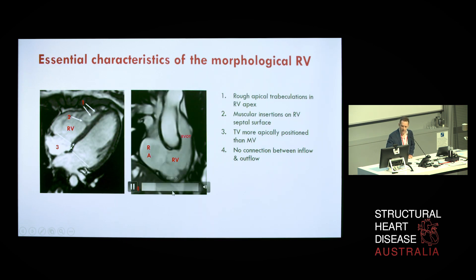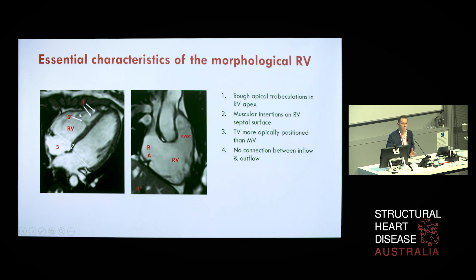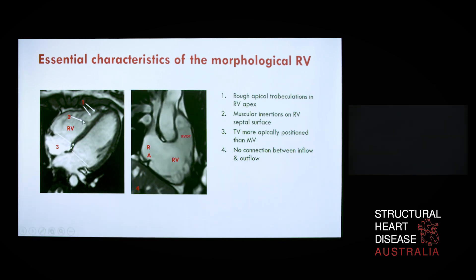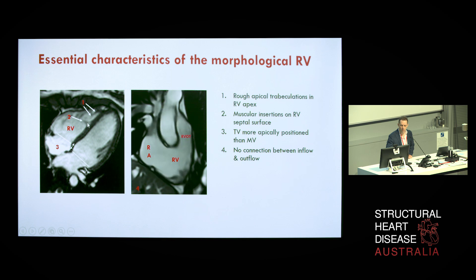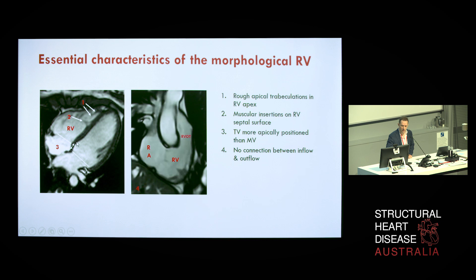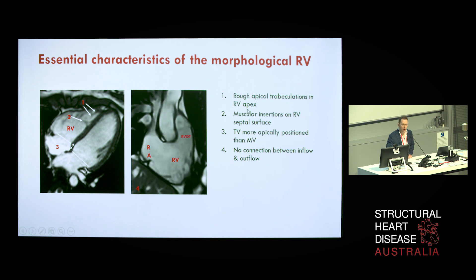Once we achieve a four-chamber view, this image illustrates the essential anatomic characteristics of the right ventricle: the rough apical trabeculations versus the finer trabeculations in the left ventricle, the septal wall attachments and moderator band, and the fact that the tricuspid valve is relatively apically displaced compared to the mitral valve. The lack of connection between inflow and outflow becomes very important when defining chambers in complex congenital heart disease.